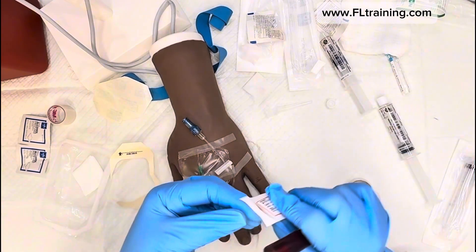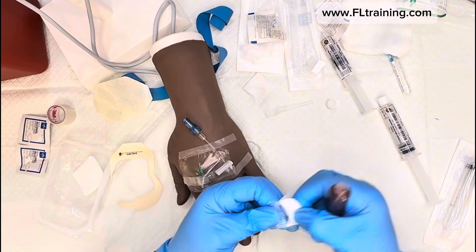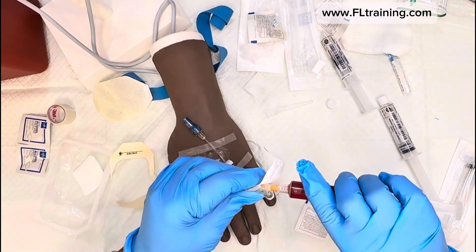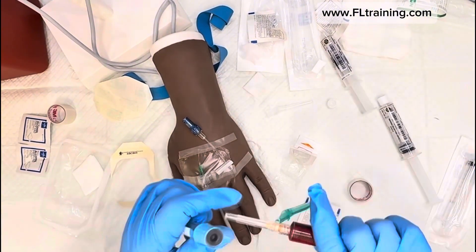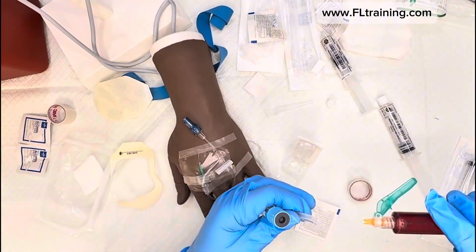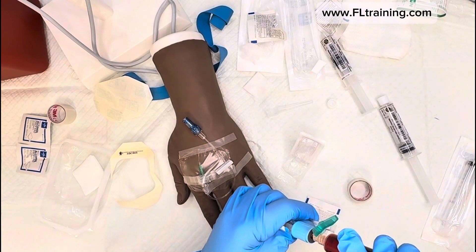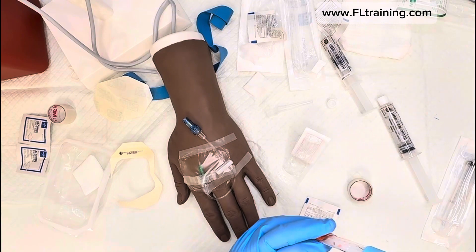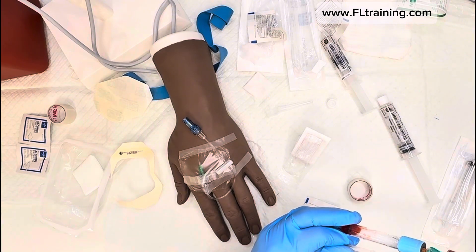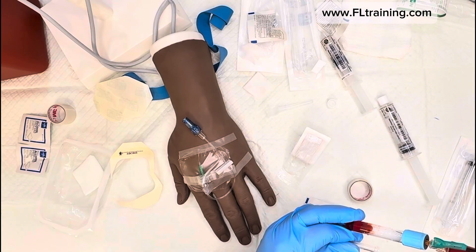Before taking off my gloves, I need to transfer the blood collected from the syringe into the blood collection tube. I do that by piercing the tube — use a needle with a larger gauge. It's going to start flowing in.